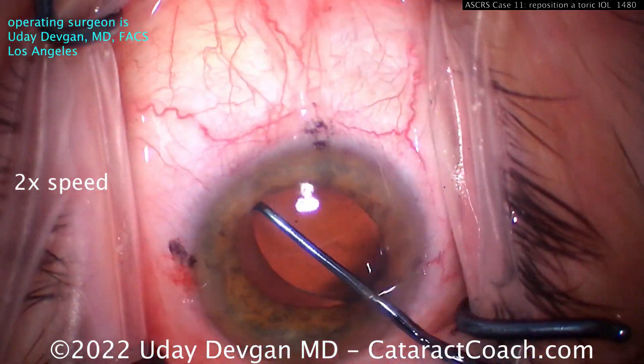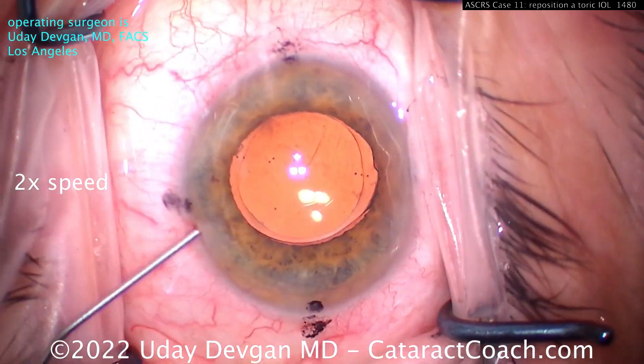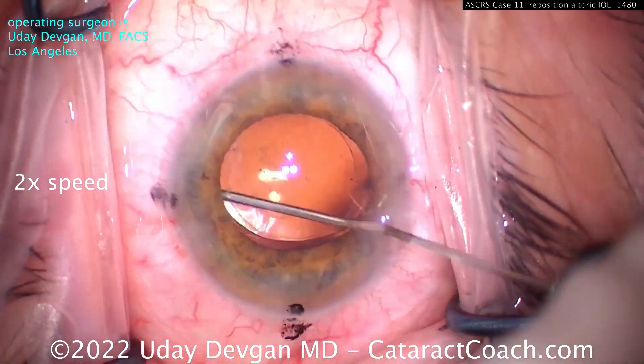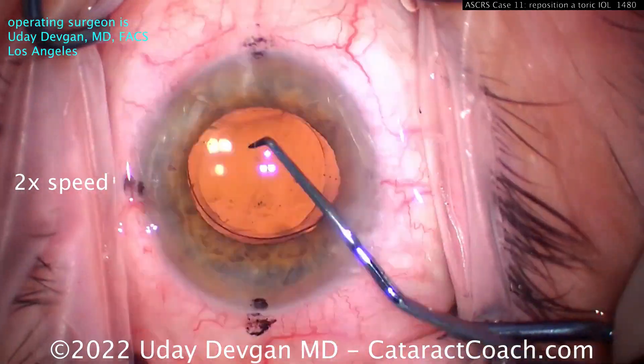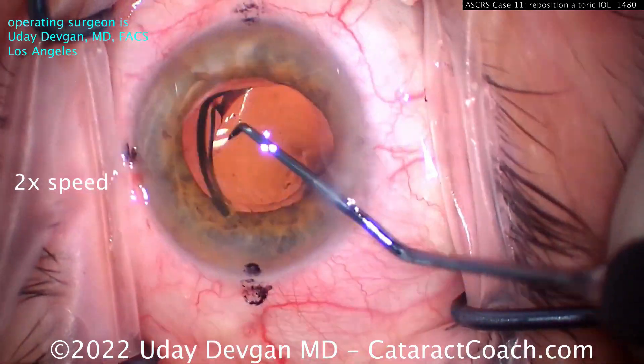Now we can see — can we lift up the lens? You can get some movement of it. I don't want to use a ton of viscoelastic. We need some, but you've got to be careful. I don't want to leave viscoelastic behind the optic — I want the new position to stay there and not have that viscoelastic acting as a lubricant.